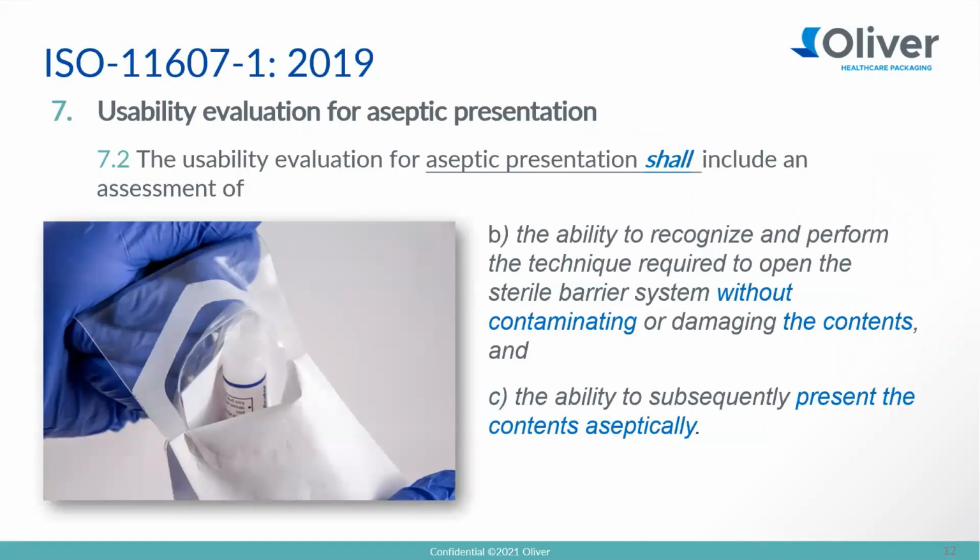Getting back to ISO 11607, in 7.2, the usability evaluation for aseptic presentation shall include the ability to open the sterile barrier system without contaminating the contents, and also present the contents in an aseptic manner.